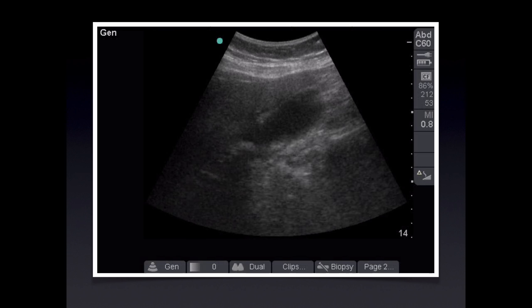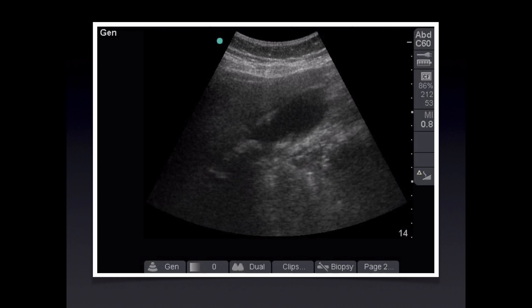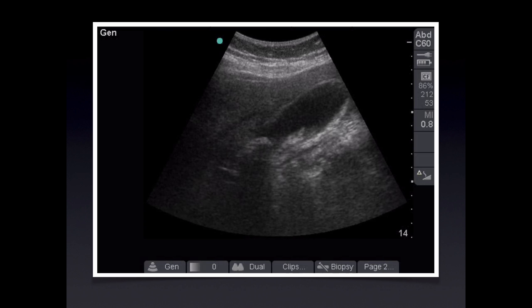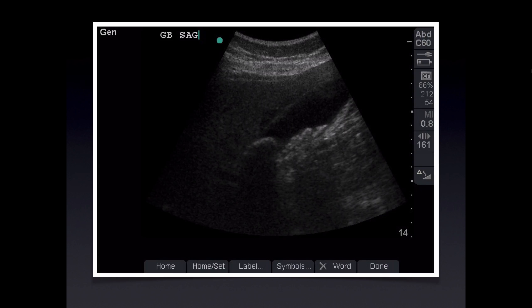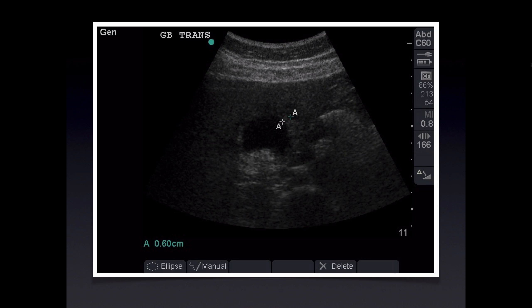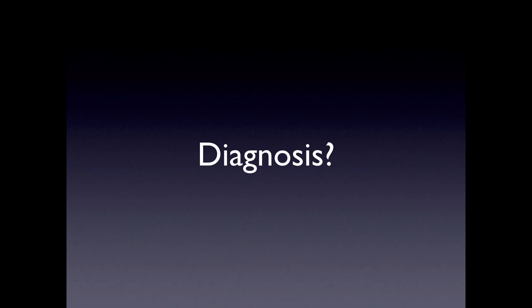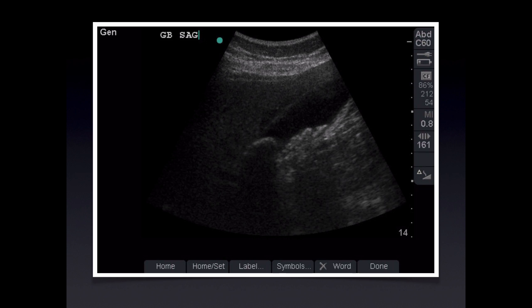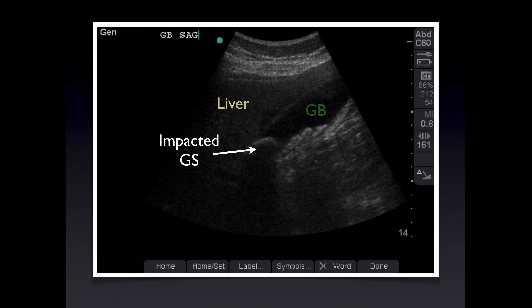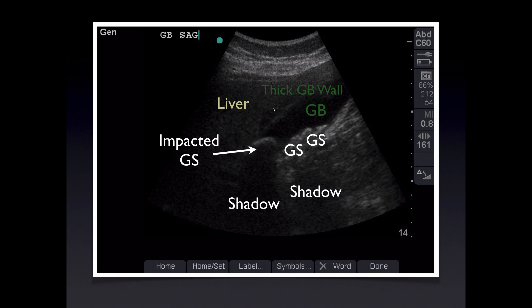Case 5: here's the gallbladder sweep — take a look at the anatomy and see if you can identify any pathology. Now measuring the anterior gallbladder wall where it interfaces with the liver edge — remember we do not measure it posteriorly or where it interfaces with bowel gas. The diagnosis is cholecystitis. We see an impacted gallstone in the gallbladder neck casting a clean dark shadow, plus a bunch of little gallstones also casting shadow. There's a thickened gallbladder wall and likely some pericholecystic fluid seen right here.